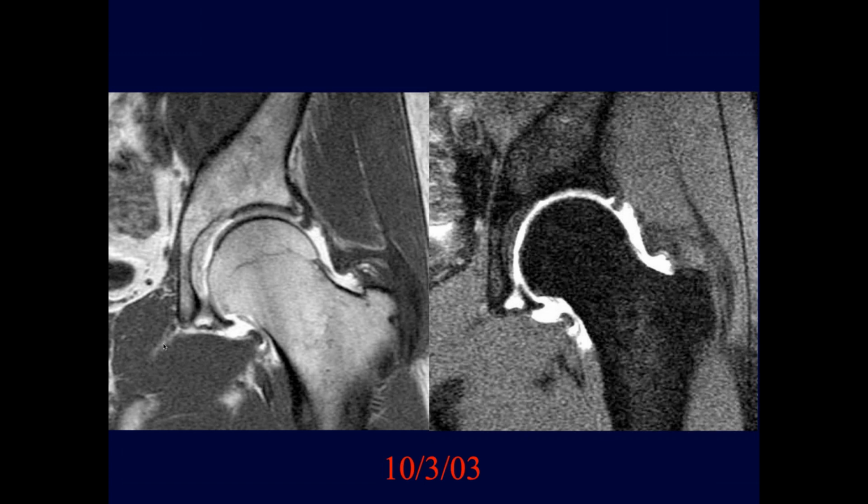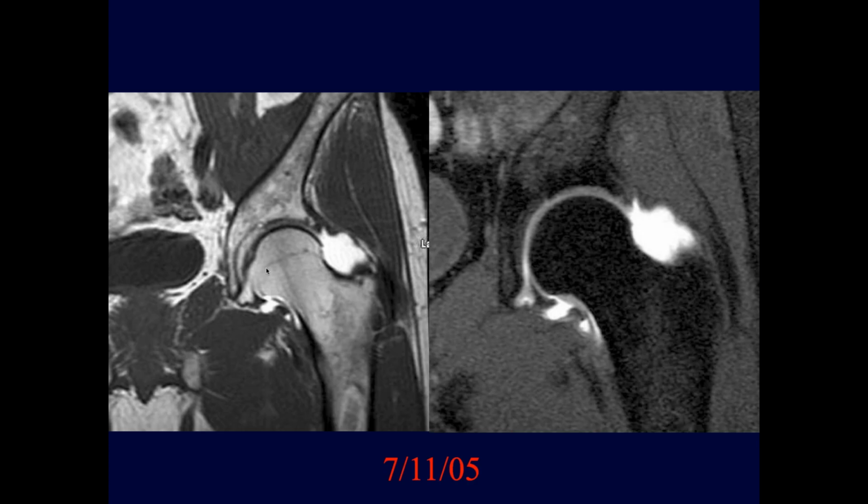Okay, this is a study from October 2003. There is some increased contrast signal at the chondral labral junction of the superior labrum. I think this could be concerning for a tear of the superior labrum. There's a little bit of irregularity in the adjacent bone here, which makes me a little bit more suspicious than if the bone were entirely normal.